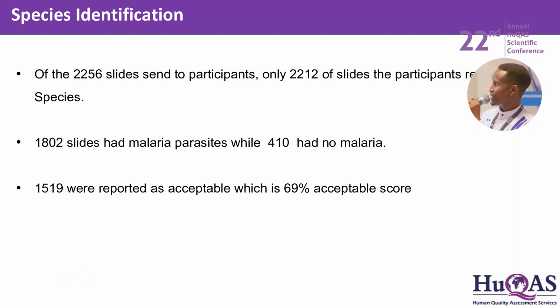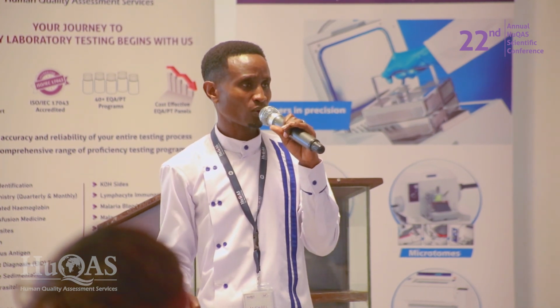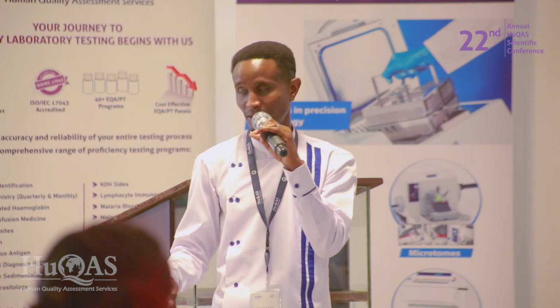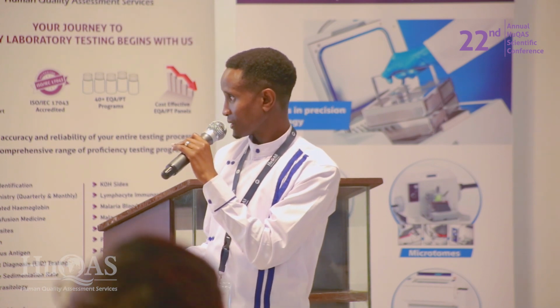In those slides, 1,802 were positive for malaria, different species, and 410 were no malaria parasite slides. This was an average score of 69% as per the performance between 2020 and 2022. So this is how the data looked.